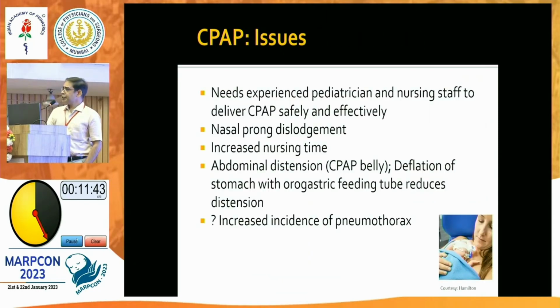Now, there are a few other issues with CPAP. Setup for CPAP needs experienced nursing staff, and the pediatrician or neonatologist himself or herself has to be very comfortable in using CPAP. Sometimes if the nasal prongs get dislodged, then there is no pressure generation, and it also increases the nursing time. But remember, all these things are there if you compare it with just plain oxygen. A baby who's on mechanical ventilation will have even more requirements compared to this.